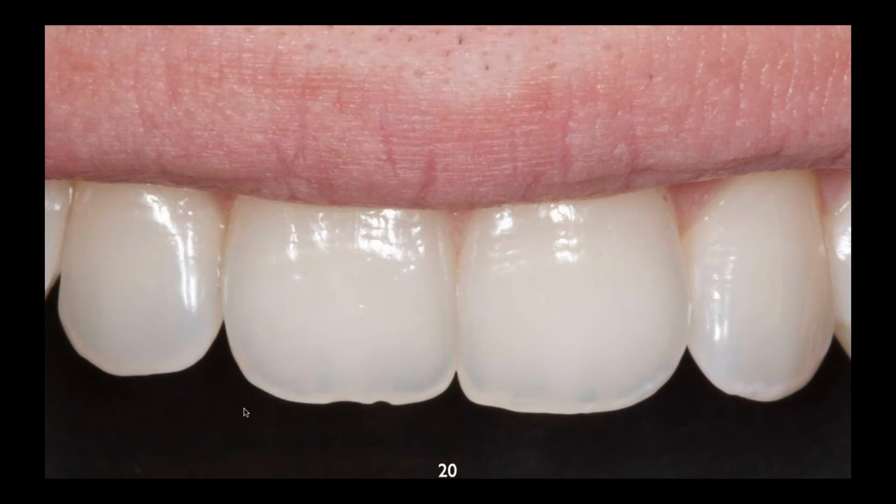I said, "Well, how do you explain that to somebody?" And she said, "Well, I don't want that in there. I want everything white." So for a lot of those cases, I just build everything up in dentin, and I don't even bother with the enamel. For what? Because if you have unbacked enamel, you're going to have more translucency.